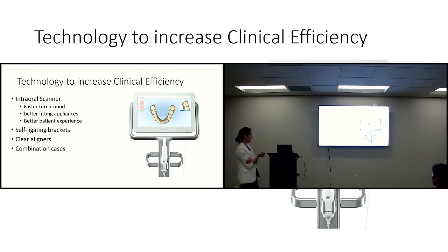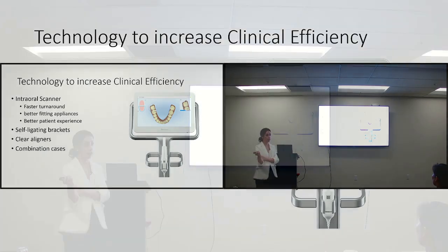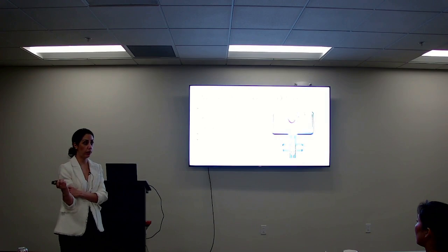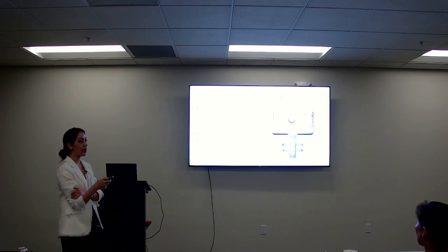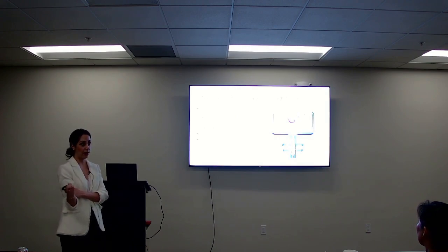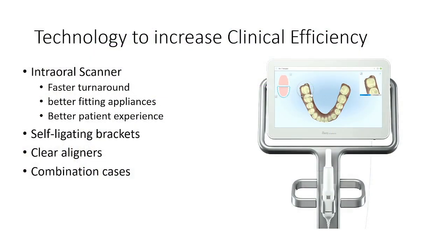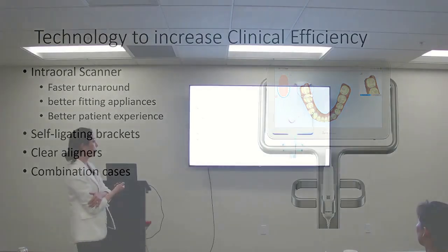For all of our retainers, I actually send everything through the scanner digitally to the lab, and then we submit a prescription. Even my Hawley retainers, all my expanders, we make it from this. We don't at all take impressions, which has really increased efficiency. My assistants do not take impressions, and they don't trim models anymore. They're just so spoiled. Like, they love it. I mean, why wouldn't I do that? You know, it costs me a couple bucks more, but then I have happier staff. I don't have as many employees as I would have if I had to do all that lab work. So we're very lean and clean, and of course the patients perceive it as a very high-end office and good experience.